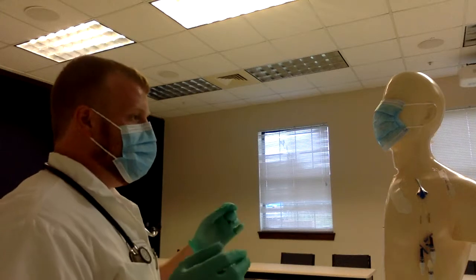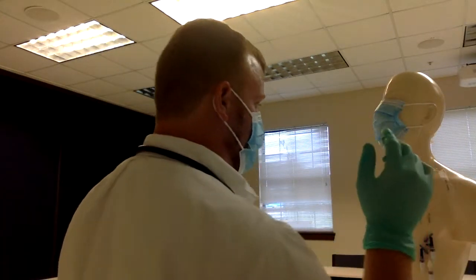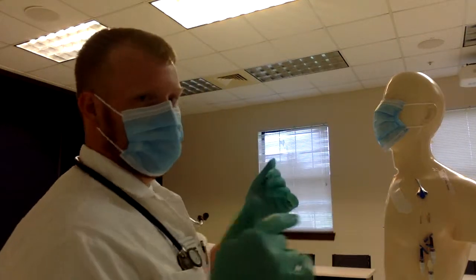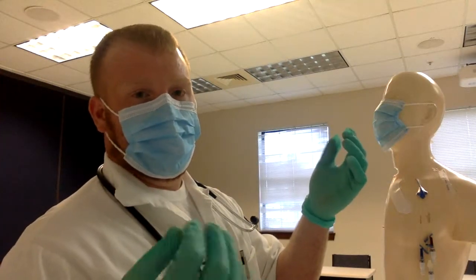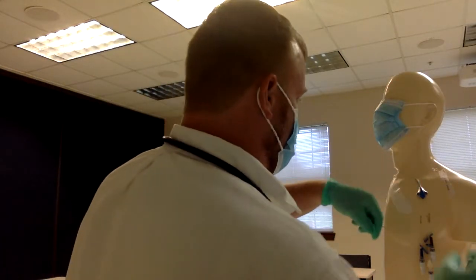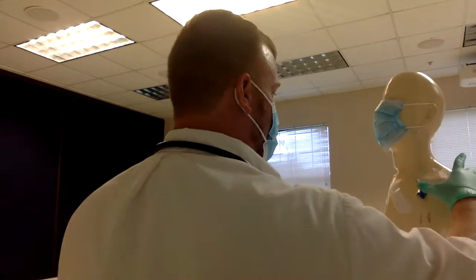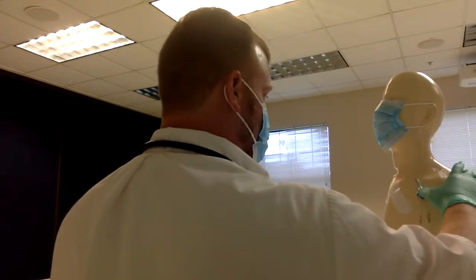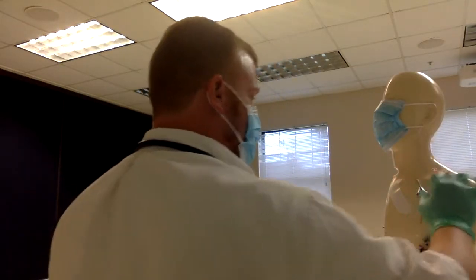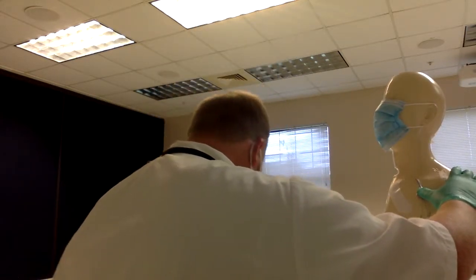I'm gonna pick a hand that I want to be contaminated. One's gonna remain sterile, and one's gonna be contaminated. So I finished pulling off. I'm gonna pick this hand here, my right hand, my dominant hand. I'm gonna keep it as the clean hand. So I remove the rest. I'm holding just the catheter now. So now this hand's sterile, my left.